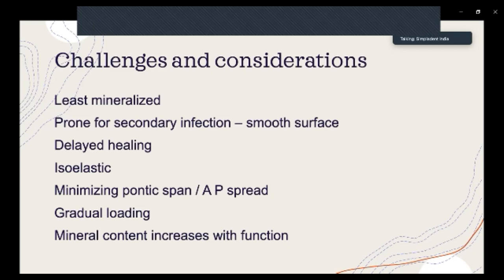We should do gradual loading over the implants because the mineral content is low. And when we do gradual loading, as per Frost's analysis or Wolff's law, the mineral content is going to increase with function and the bone is going to pick up.